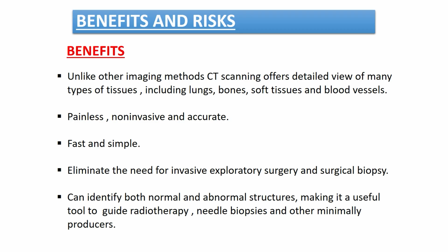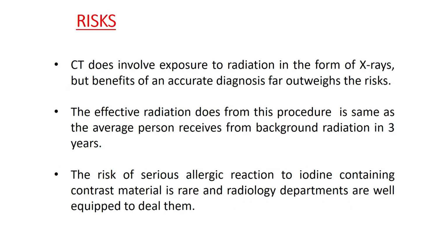It is a very fast and simple technique. It also eliminates the need for invasive exploratory surgery and surgical biopsy. We can identify both normal and abnormal structures, making it a useful tool to guide radiotherapy, needle biopsy and other minimally invasive procedures. So, these are certain benefits regarding the CT scan.